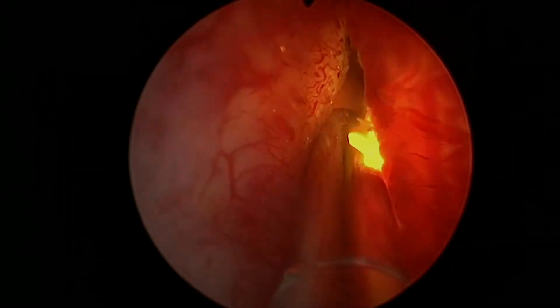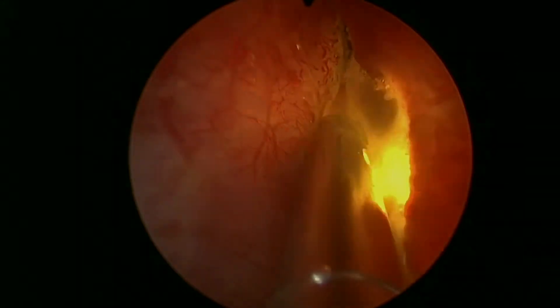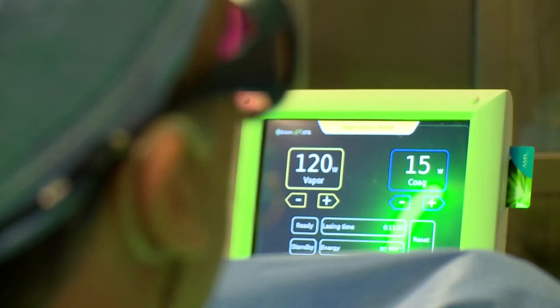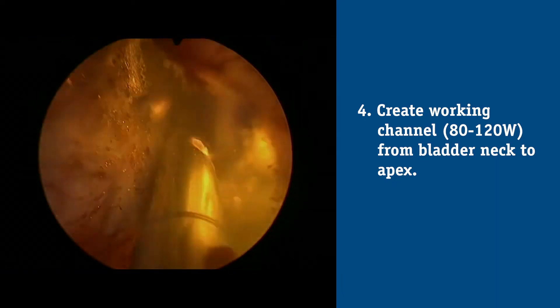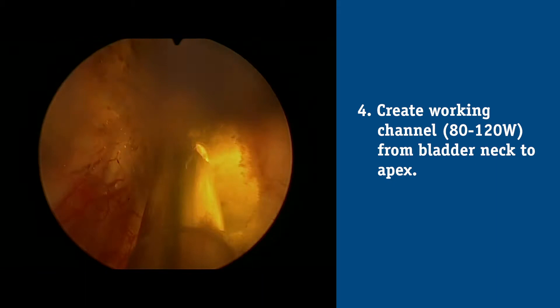The first step, if the lateral lobes are touching, is to make a working channel between 9 and 3 o'clock on low energy with a fast sweep. Once there's good flow with the continuous flow cystoscope and I can visualize the median lobe, the next step is to identify the proximal capsule there.